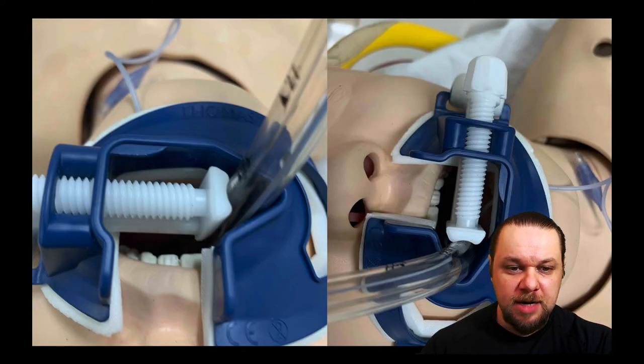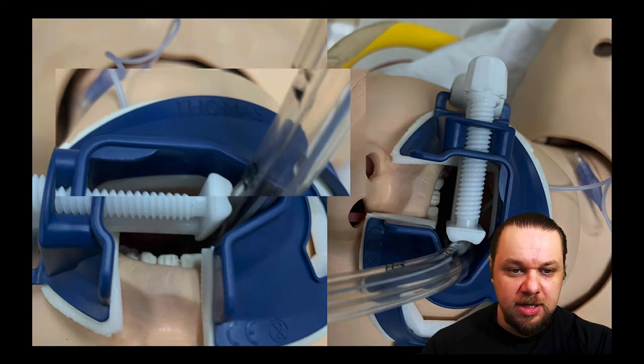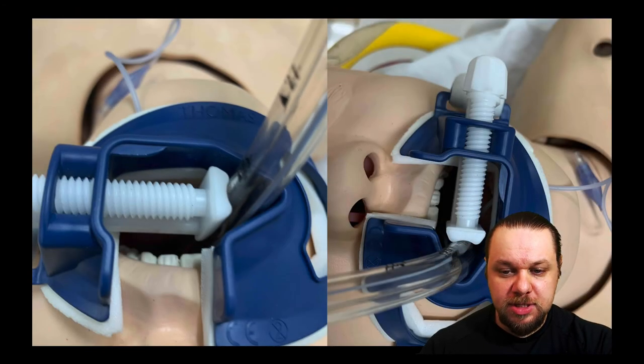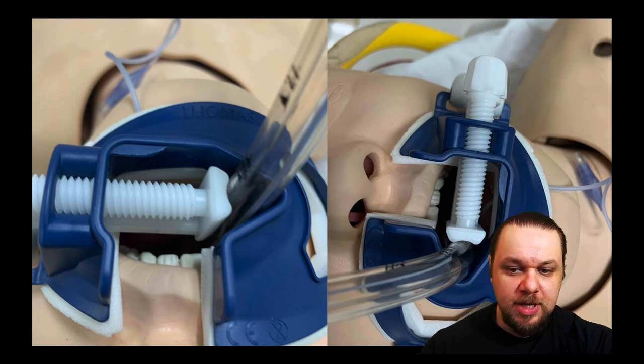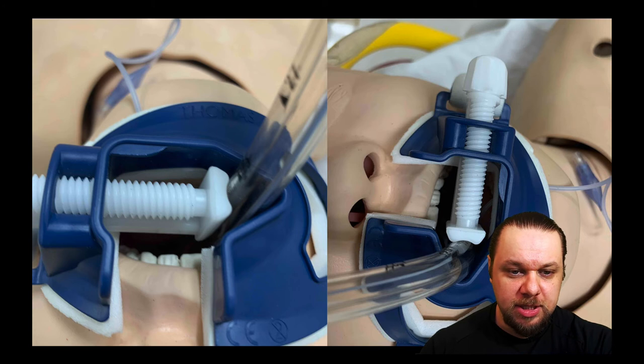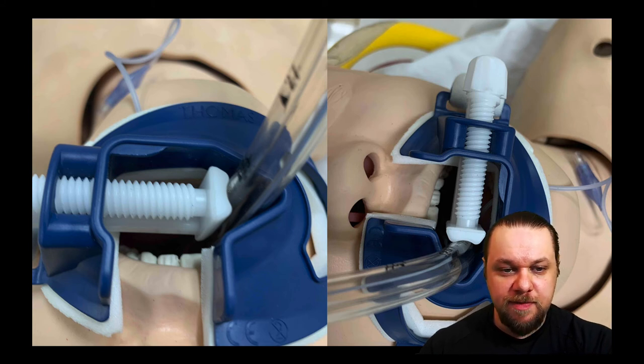A lot of instructors think that when you place this device you should be able to read 'Thomas' legibly — meaning it's upside down. The problem with this is: first, you're not following manufacturer's guidelines; and second, you would not be able to suction the mouth or pharynx with a Yankauer or rigid suction because the screw clamp is blocking entry. Whenever an instructor tells you the label should be readable, send them this video and the manufacturer's guidelines.